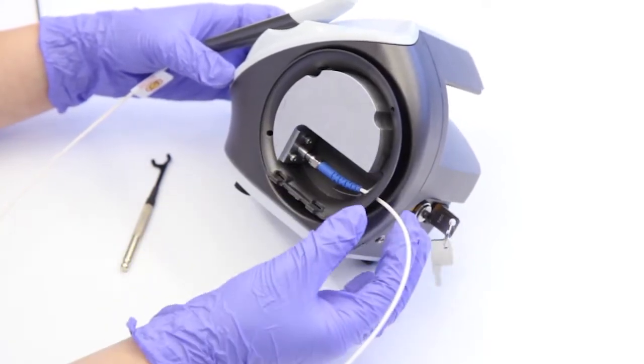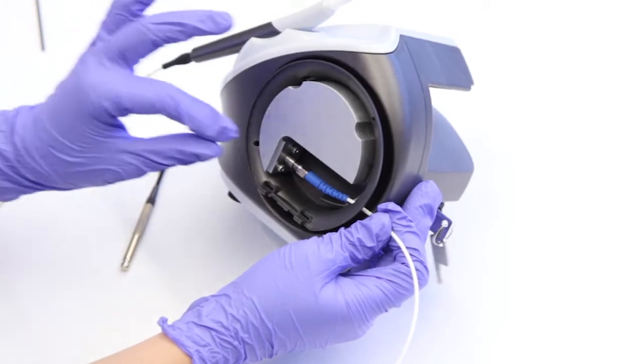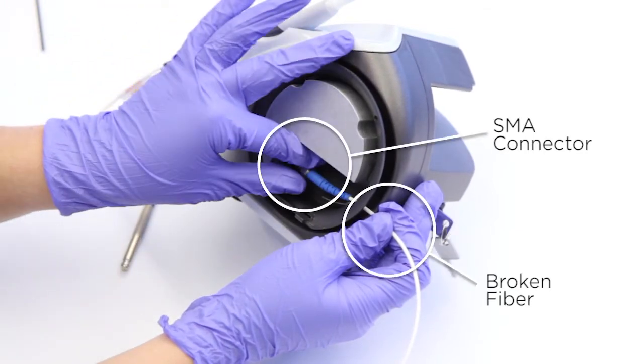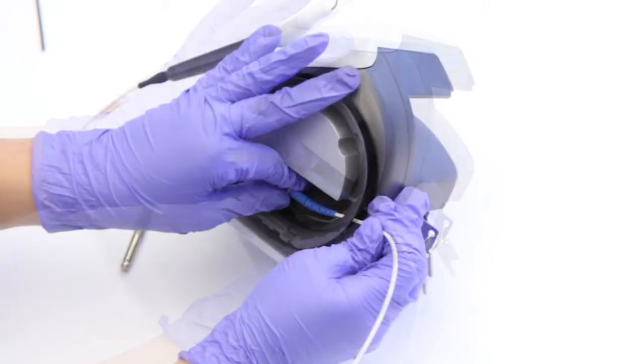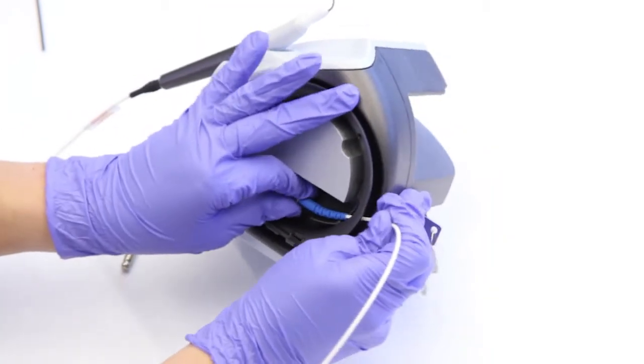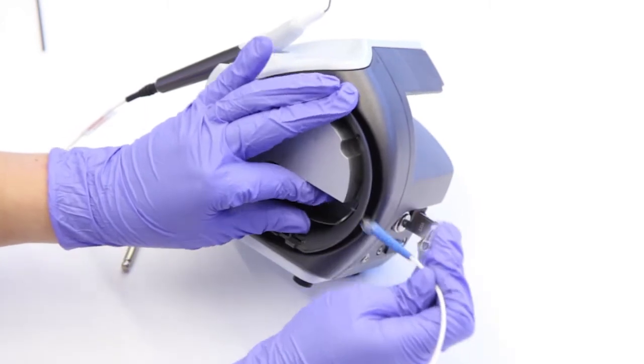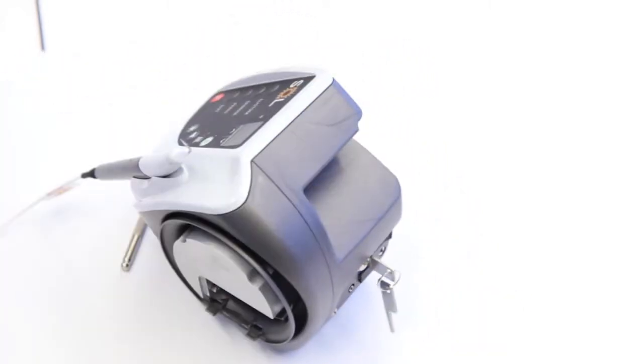To remove the fiber, firmly grip the SMA connector with your left thumb and forefinger while gently pinching the fiber exiting the wind body with your right thumb and forefinger. Simultaneously pull the SMA connector and fiber to the right away from the diode aperture until the fiber is removed from the wind body.